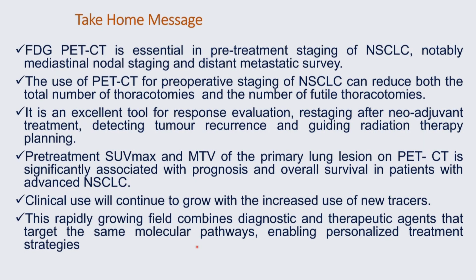So, FDG PET-CT is essential in pre-treatment staging of non-small cell lung cancer, notably mediastinal nodal staging and distant metastatic survey. The use of PET-CT for pre-operative staging of non-small cell lung cancer can reduce both the total number of thoracotomies and the number of futile thoracotomies. It is an excellent tool for response evaluation, re-staging after neoadjuvant treatment, detecting tumor recurrence, and guiding radiation therapy planning.